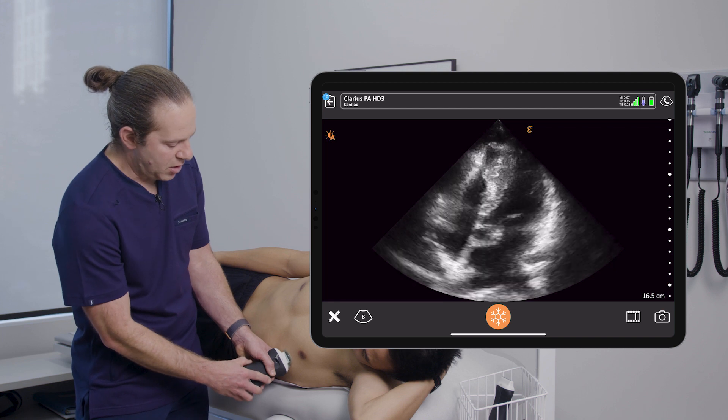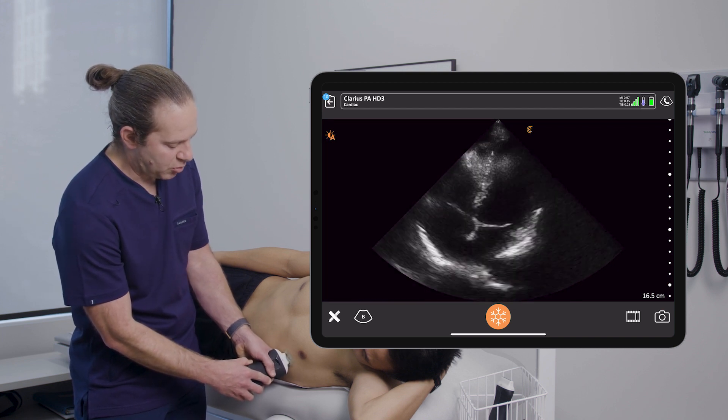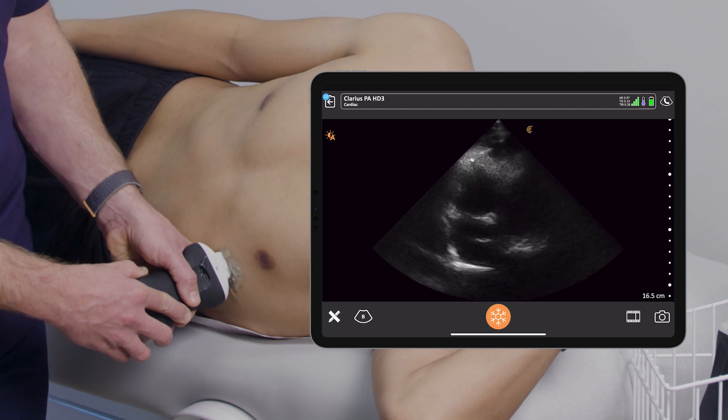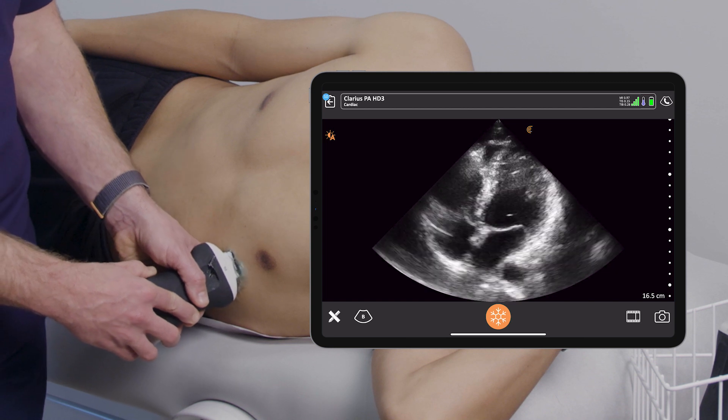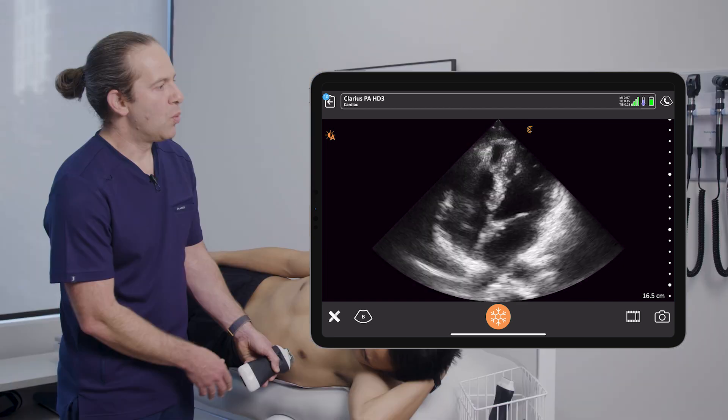From here, I'll have to do some micro-movements, kind of like a tic-tac-toe board — up, down, and to the side — really trying to optimize my window of the heart.